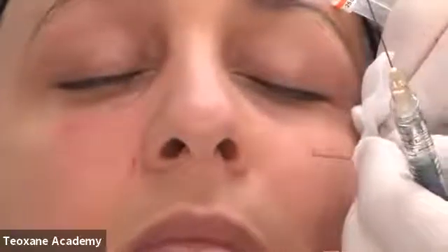So here, I do my entrance point. You remember, straight to the bone, deep on the bone, giving the direction, as you can see here. I will introduce my cannula. So you see there is no blood here. And I will introduce my cannula in the little hole, follow the path, and you see there is no resistance. It's sliding on the bone.